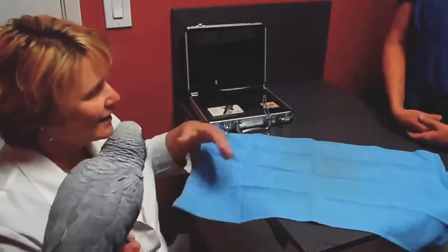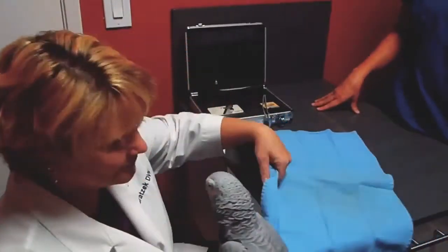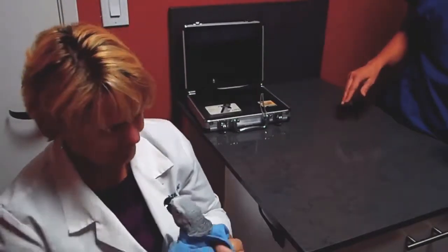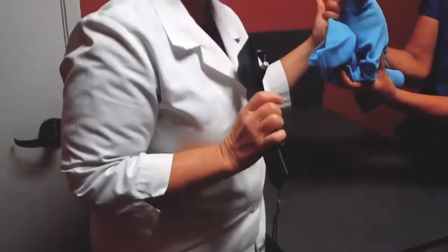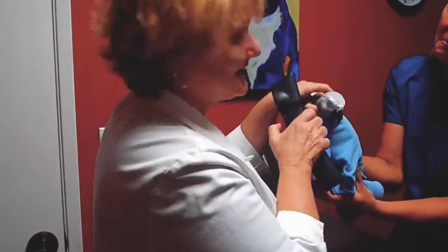So the hardest part about this is how to wrap a bird. And you can see Smitty is going to be very, very mad about this. After the initial trauma, see how easy it is to take pressures.